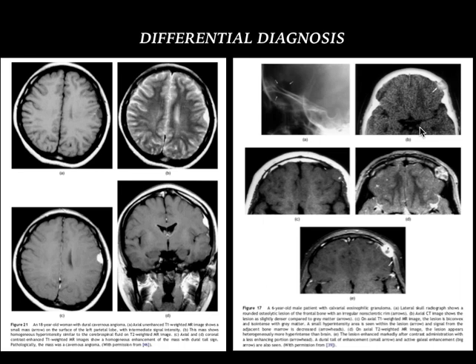This is another case of a six-year-old male patient presenting with a lytic lesion in the bone. You can see the calvarial lesion, which is like a punched-out lesion, again showing dural thickening on post-contrast. You can see the lesion is enhancing — the calvarial lesion — and you can see the dural thickening and enhancement adjacent to it.